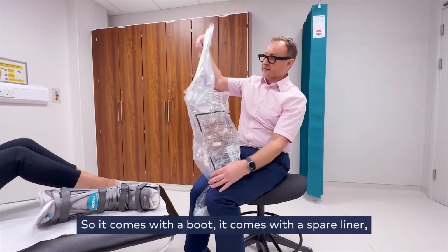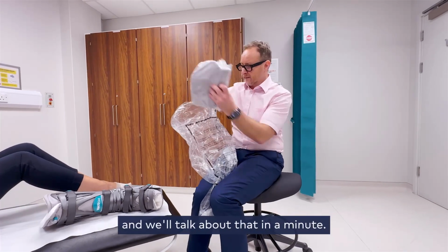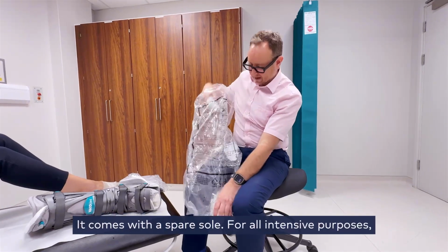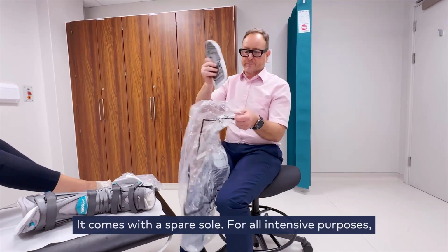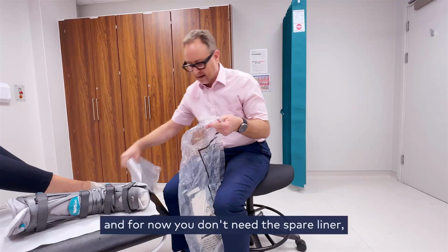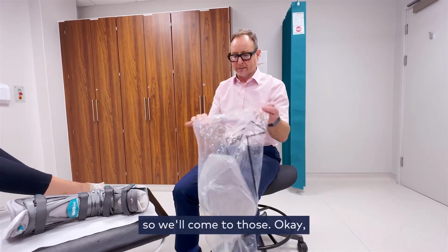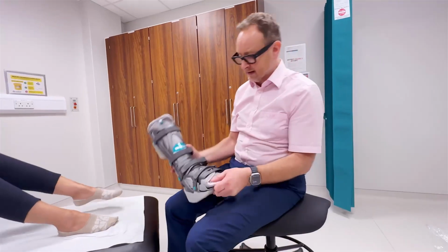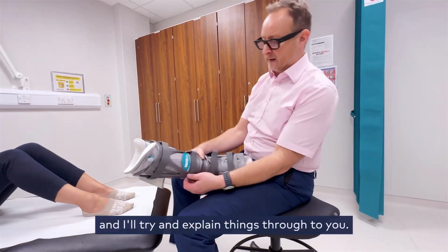It comes with a spare liner, and we'll talk about that in a minute. It comes with a spare sole. For all intents and purposes, you don't need the spare sole. And for now, you don't need the spare liner, so we'll come to those. Okay, so this is the boot. It's quite complicated, and I'll try and explain things to you.